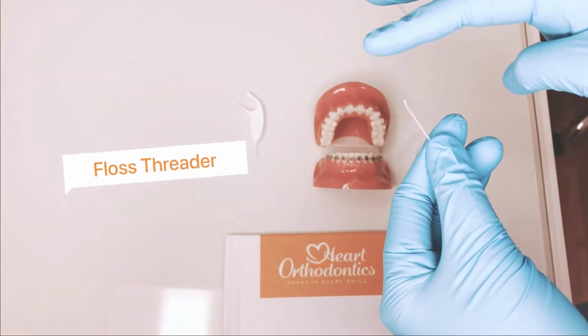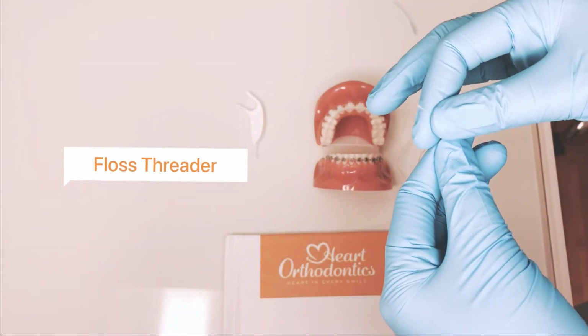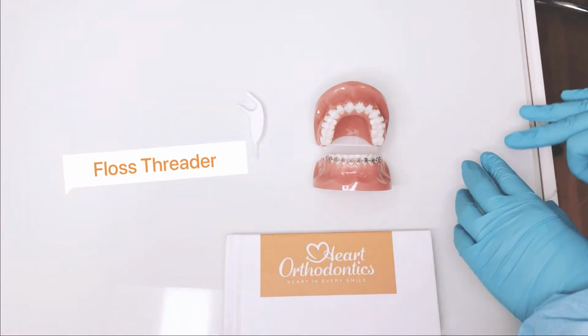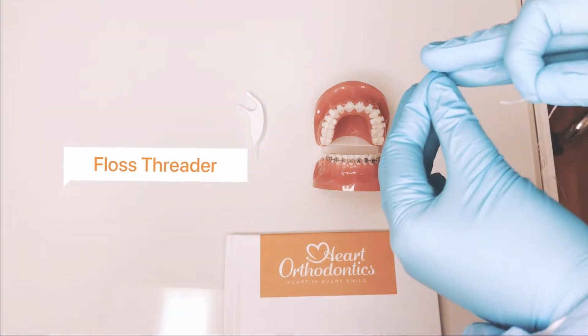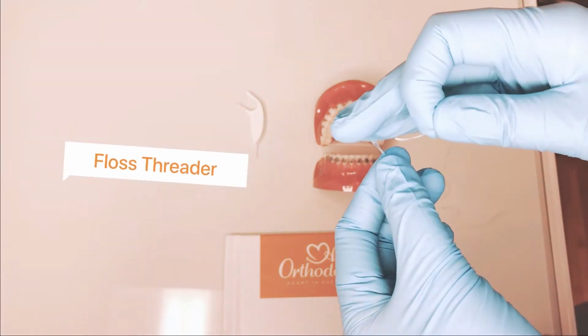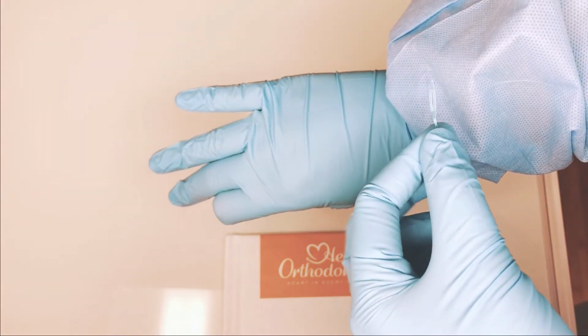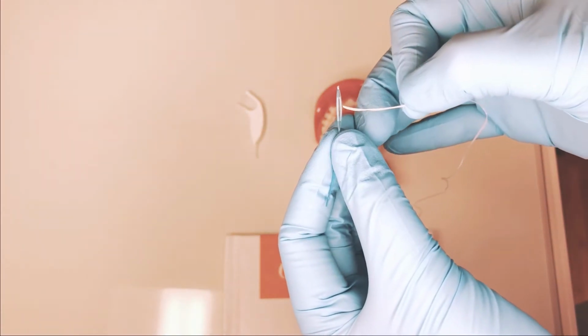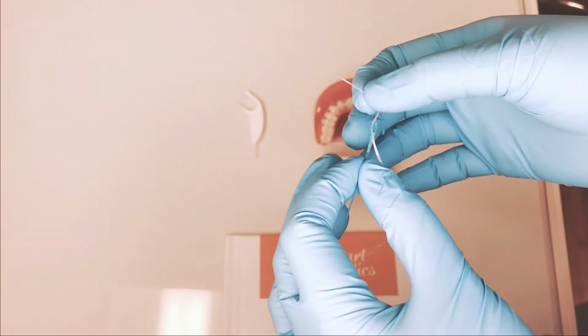Next up is flossing. Included in your kit are some floss threaders to use with regular floss. The floss threader is flexible, but also a little stiff to help guide your floss better. Thread your floss through the opening and pull a short segment through.